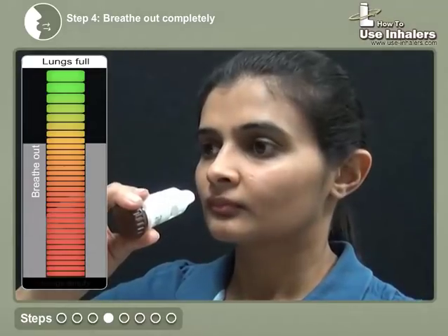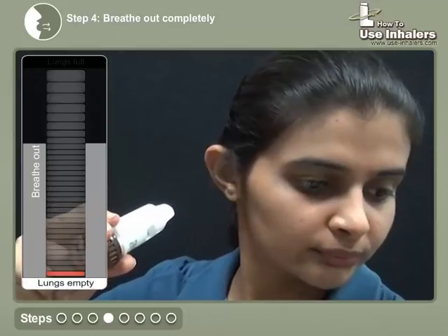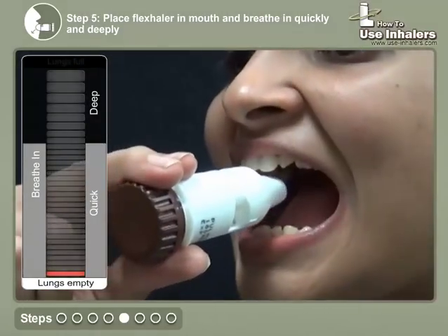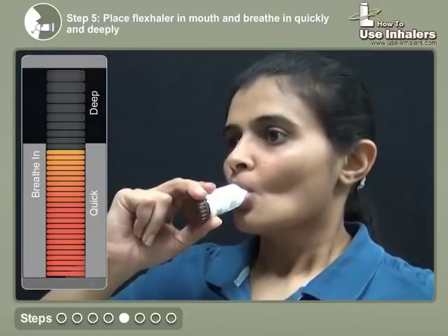Breathe out completely away from the flexhaler. Place the mouthpiece in your mouth and breathe in quickly and deeply, while holding the flexhaler in a horizontal position.